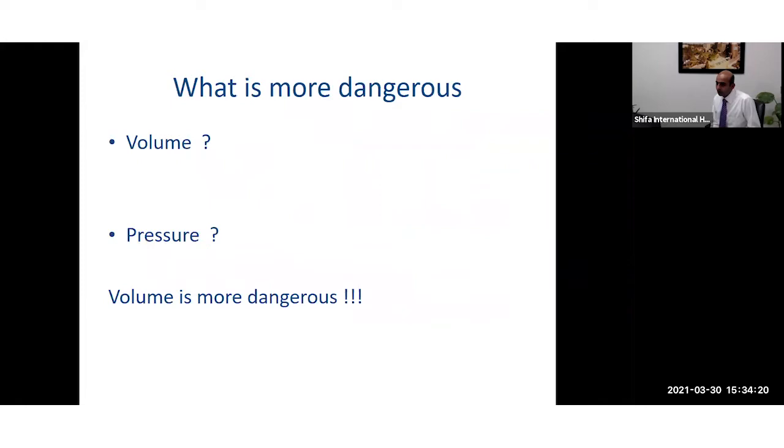So the question we want to ask ourselves is what is more dangerous, whether we should be controlling the volume or whether we should be using the pressure. And the evidence is fairly clear that the volume is more dangerous.